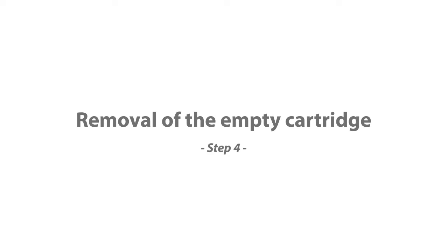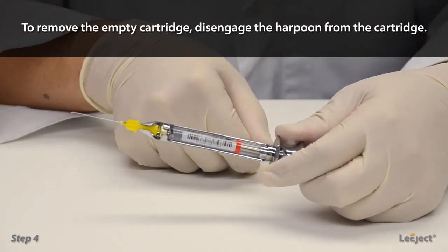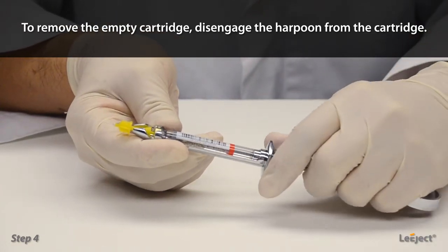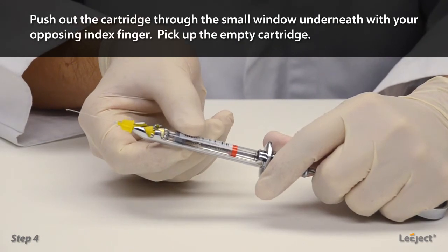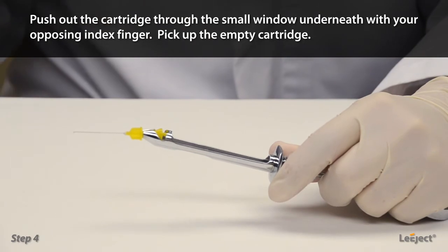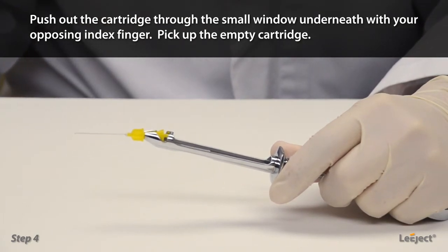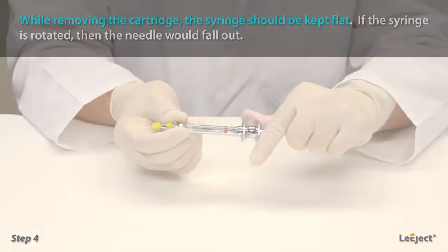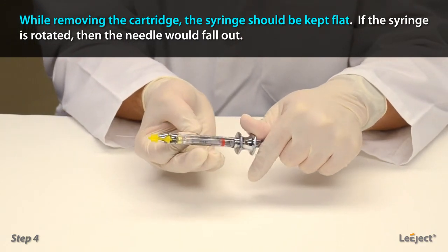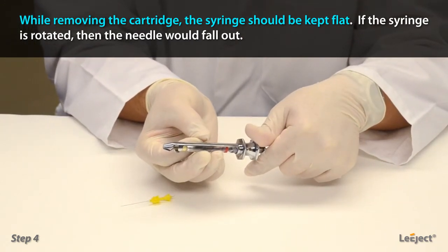Removal of the empty cartridge: to remove the empty cartridge, disengage the harpoon from the cartridge. Push out the cartridge through the small window underneath with your opposing index finger and pick up the empty cartridge. While removing the cartridge, the syringe should be kept flat. If the syringe is rotated, then the needle would fall out.